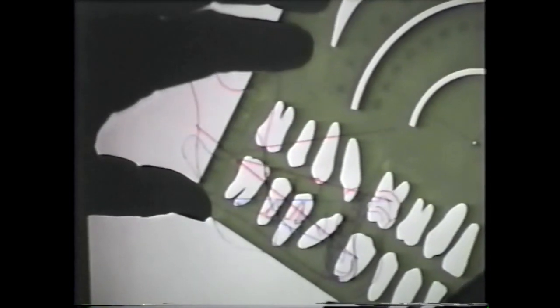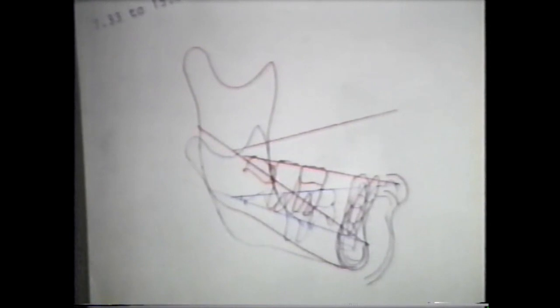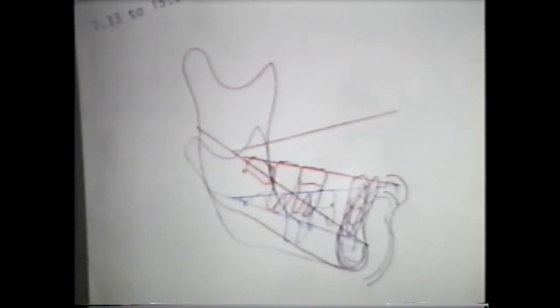Now, because this is only here now, you've got 3/4 of the tooth behind, so there's only a 25% or 20% likelihood that this third molar would erupt. So this would mean that that third molar is going to be impacted. At the age of 8.5, there's a hole there in the x-ray. It's the germ of a tooth. Now, it looks like it's down in the bone, but it's sitting on the surface of the bone.